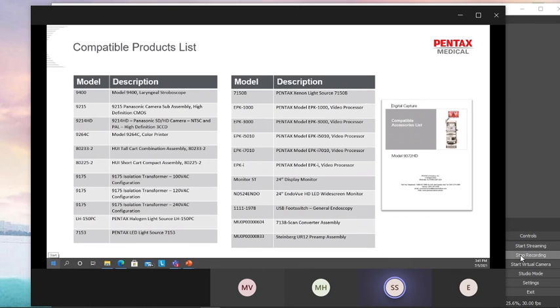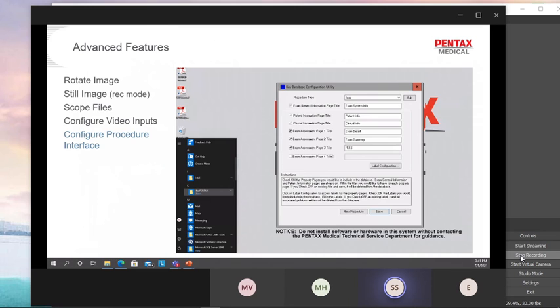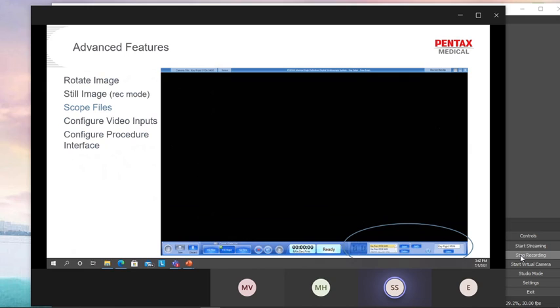So if you are using that monitor, you'll see cut away. Basically the entire portion here will be cut away. If you are using 1920 by 1080, you'll not see the KDS taskbar. This KDS taskbar will be entirely gone.